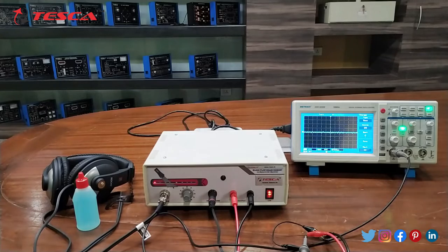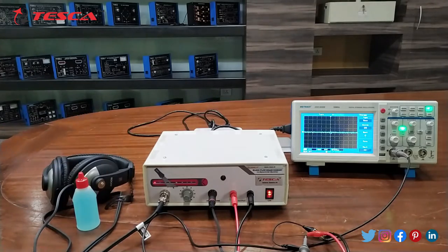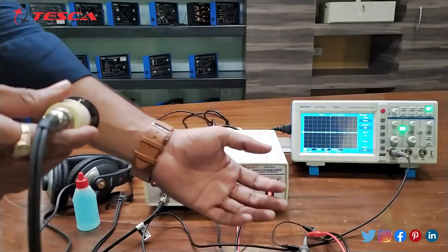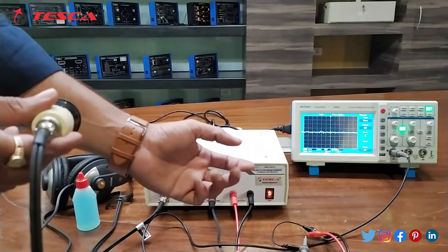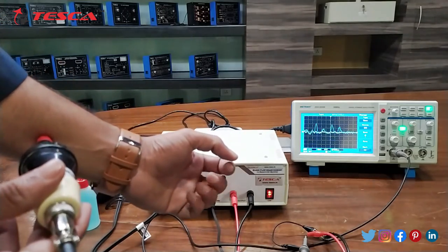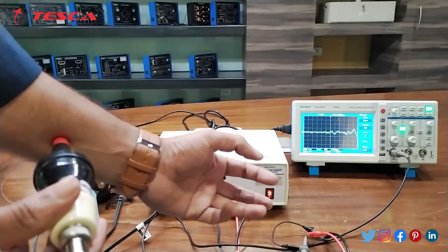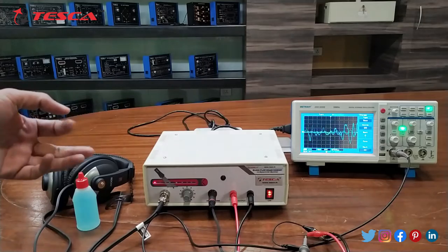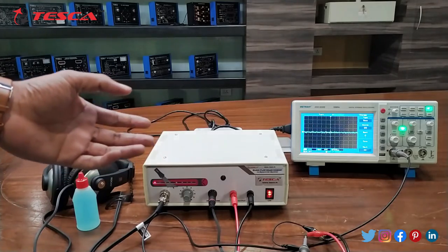If you want to get better signal at the output on the DSO then you should keep the audio at around 7 or 8 and put the transducer on your hand like this and move like this. Here you can see that on the DSO the signals are better and you can hear the audio on the headphone also. That is how you can get better waveforms on the DSO.